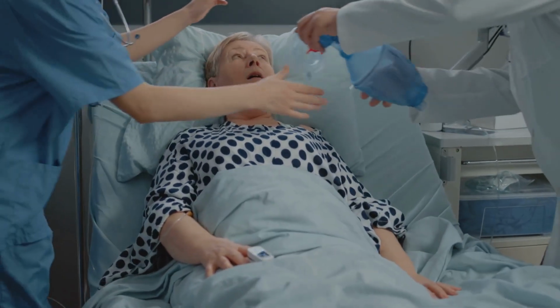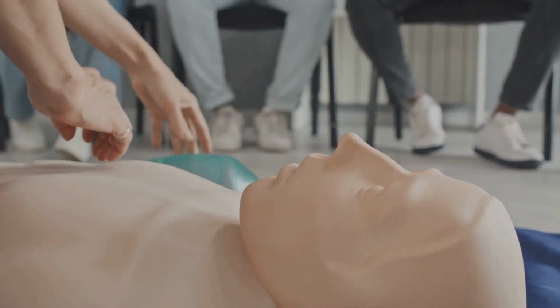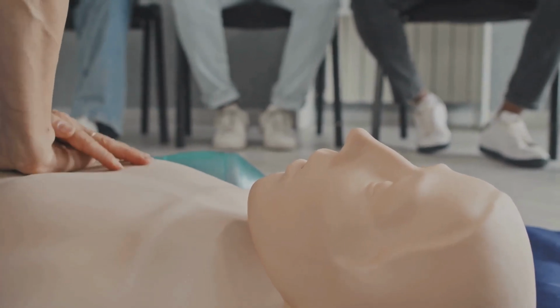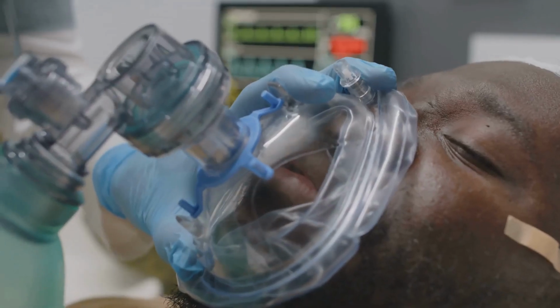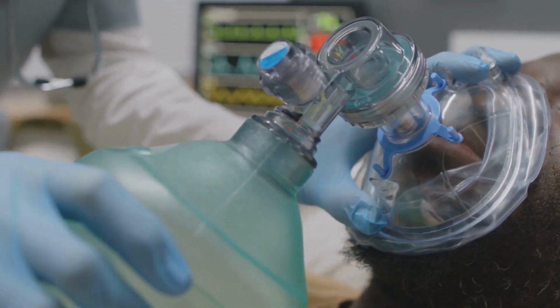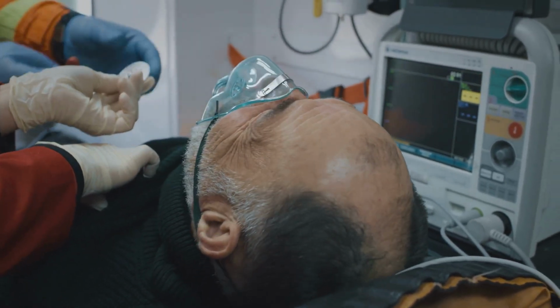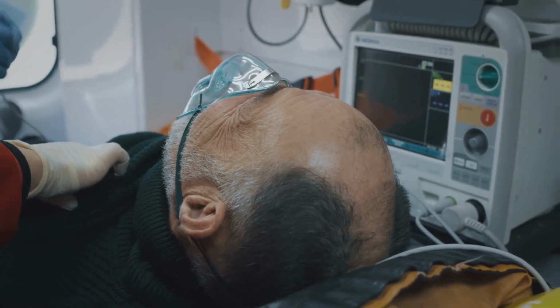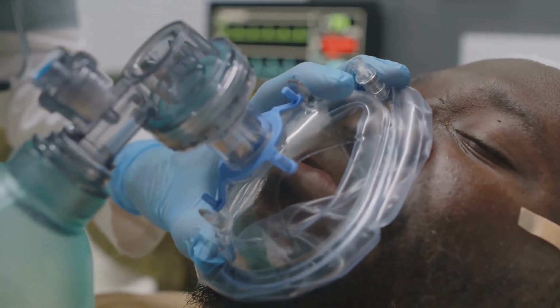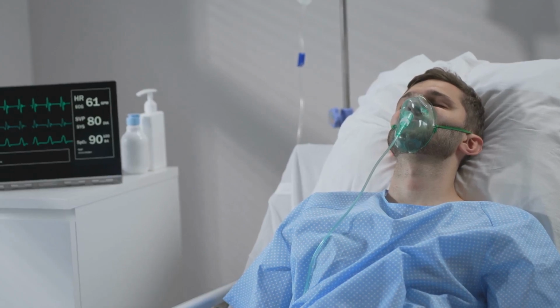We then moved on to the second method, which also involved intubation without maintaining ventilation, but without an oral airway. This technique requires a higher level of skill and precision, as it lacks the guiding structure provided by an oral airway. The third technique we explored was intubation while mask ventilating using an oral airway and an Aintree catheter. This method provides continuous ventilation and is particularly useful in patients with difficult airways or those who cannot tolerate periods of apnea.